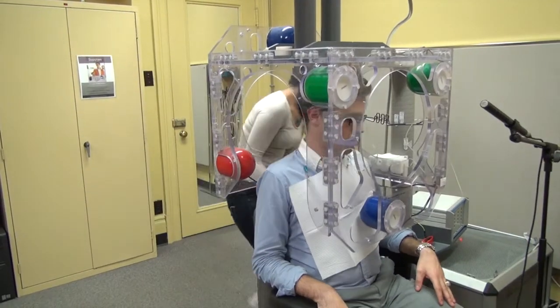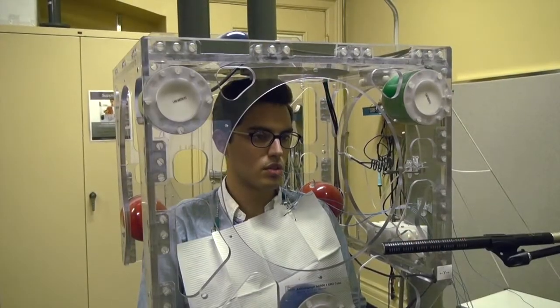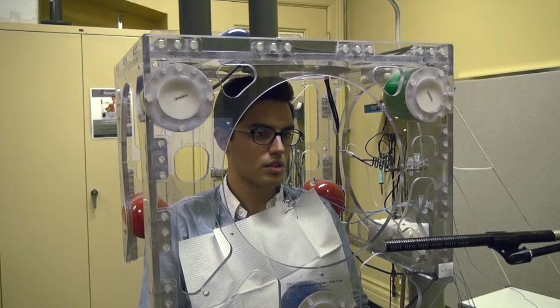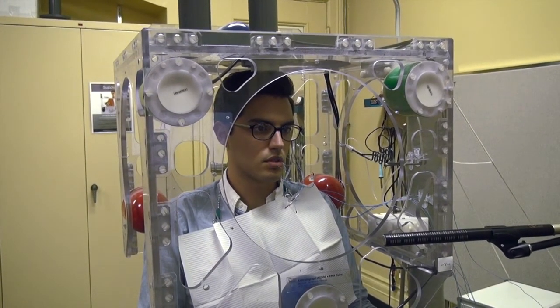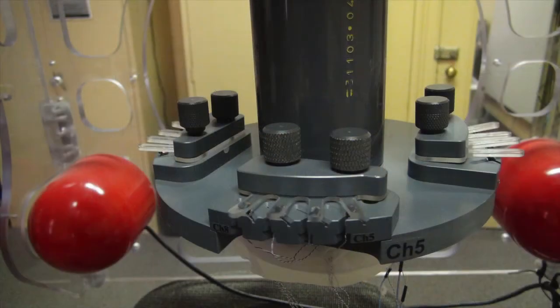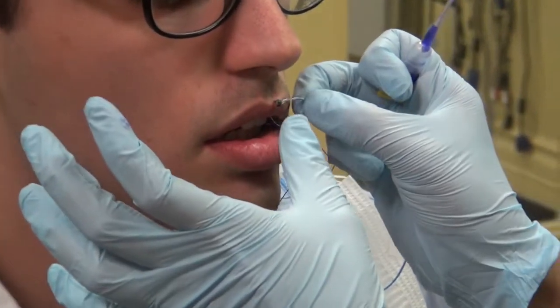An EMA system includes a cube mounted with electromagnetic transmitters that surround the head, neck, and shoulders of the participant, and coils with electrode sensors that are temporarily glued to the participant's articulators.